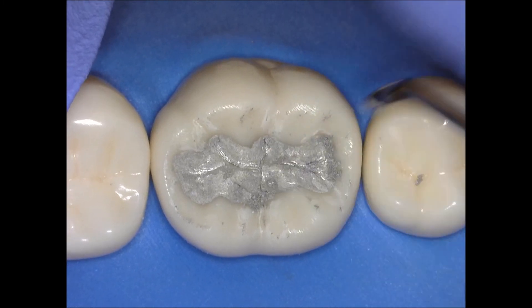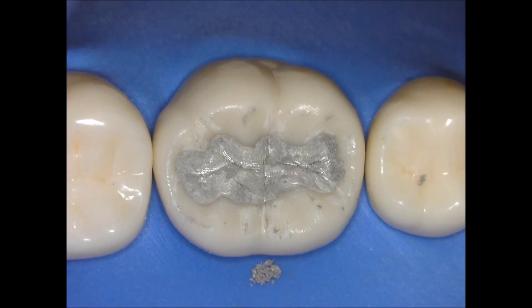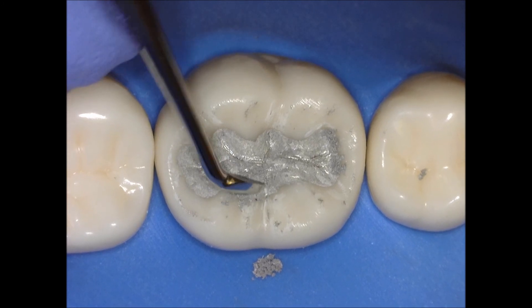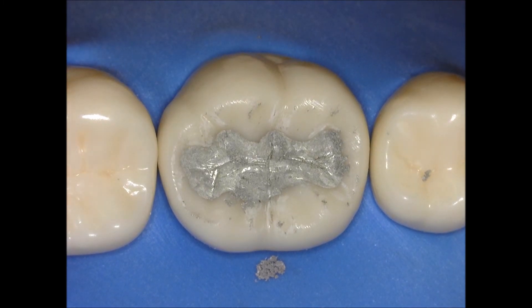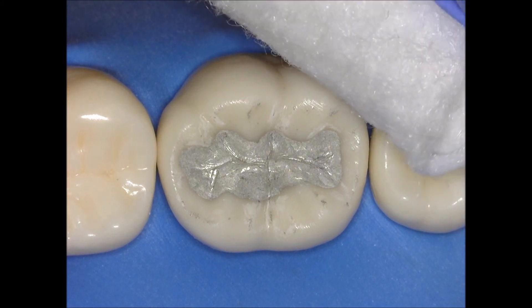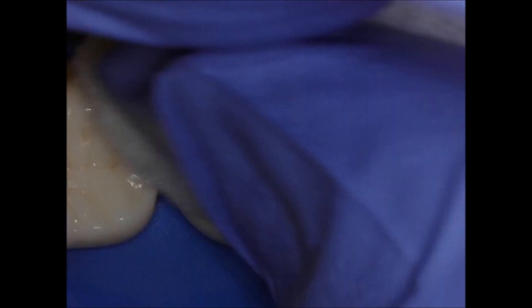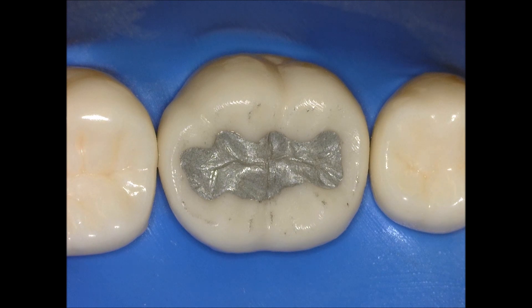The next step will be to go with the burnisher and polish a little bit more. I'm not going to do that right now — I just want to show you what you can get from carving. Remember, amalgam has to be polished after 24 hours because it takes 24 hours to reach its full compressive strength. At this point I'm just going to clean it up, make sure it's wiped down with a 2x2, and this is pretty much your final product.